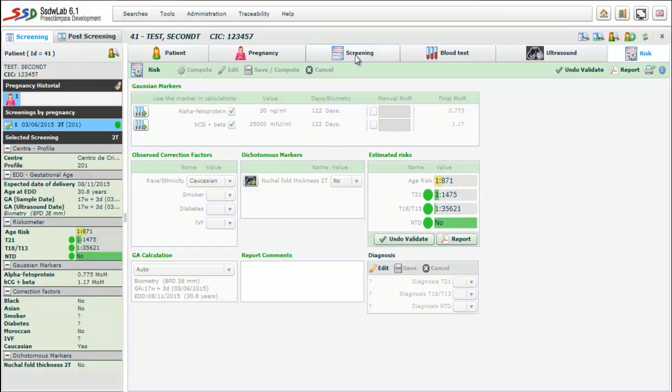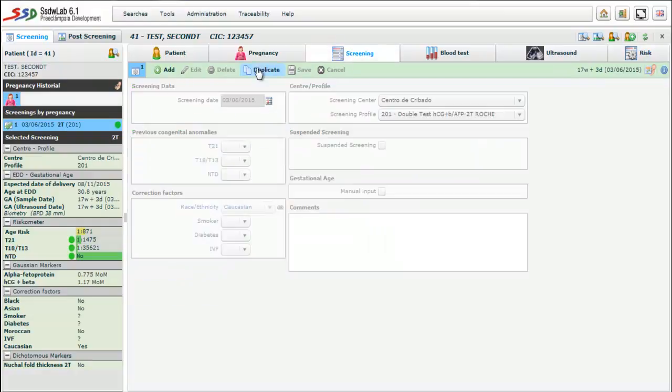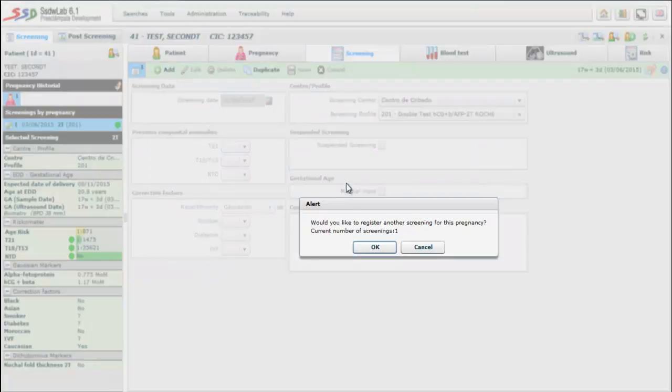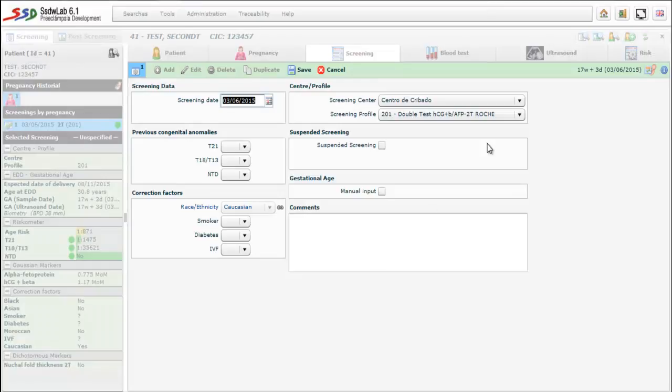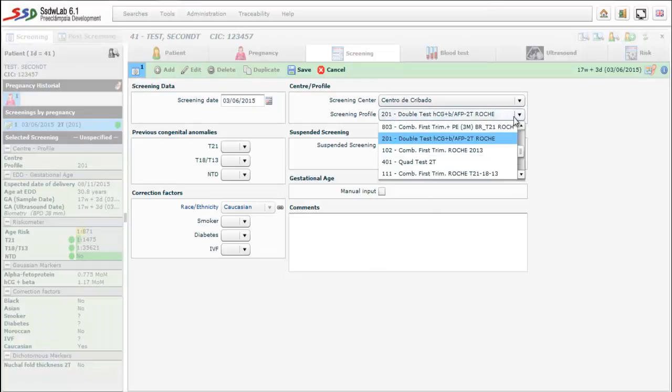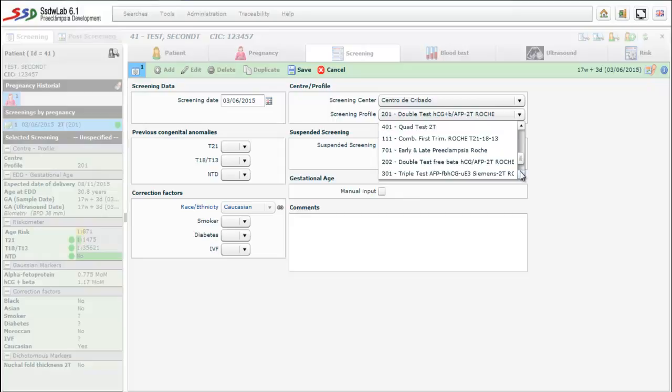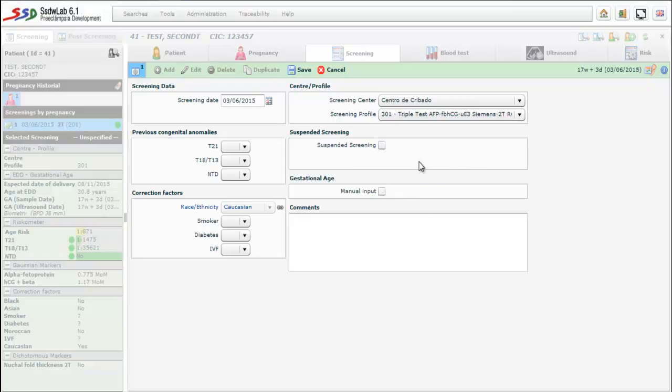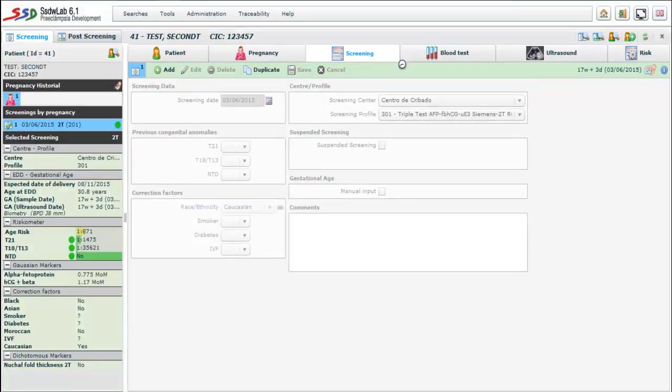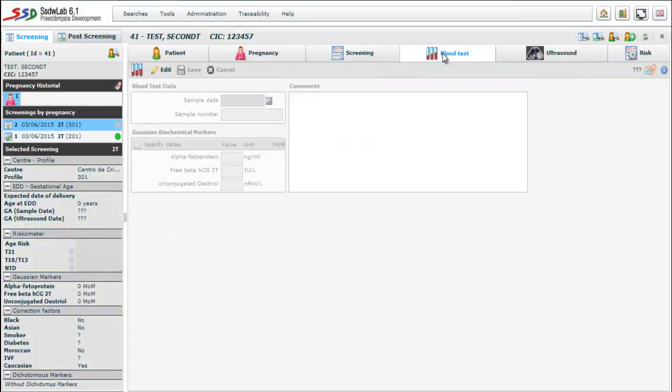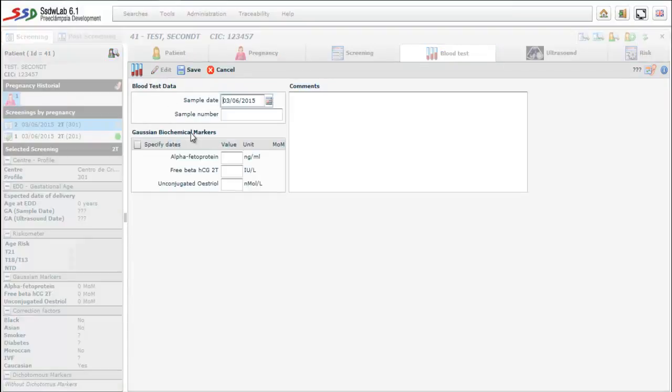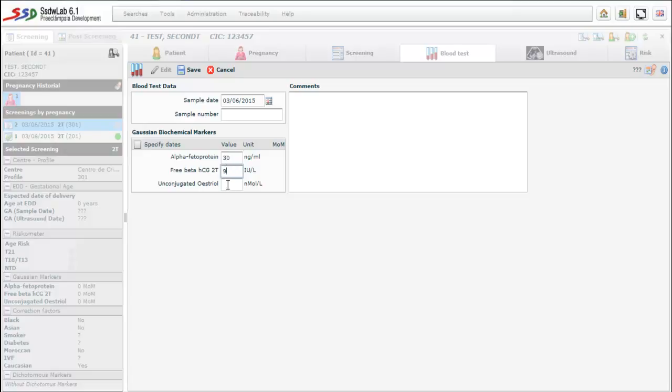If we go back to the screening folder and we click to the button we could apply other screening tests to this patient. Now we choose a triple test, which is other kind of a second trimester test. In the blood test we can observe that now we have three different Gaussian markers: alpha-fetoprotein, second trimester free beta-human chorionic gonadotropin, and unconjugated estriol.